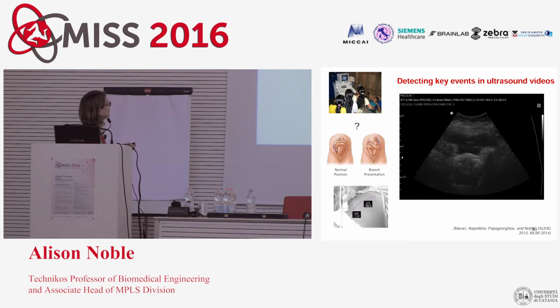A simple one that you would very rarely see in the Western world is when a mother turns up, you've never seen her before, she's unwell, you sense that the fetus is unwell, and the person who's got to make the decision is not an expert sonographer. The simplest thing that's useful for them to know is whether the baby's head is down or head up. This is the normal position for delivery. This is what's called breech presentation, when the baby's not positioned correctly, and this is very important for risk assessment.